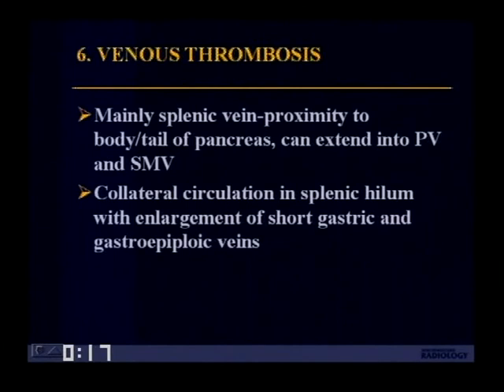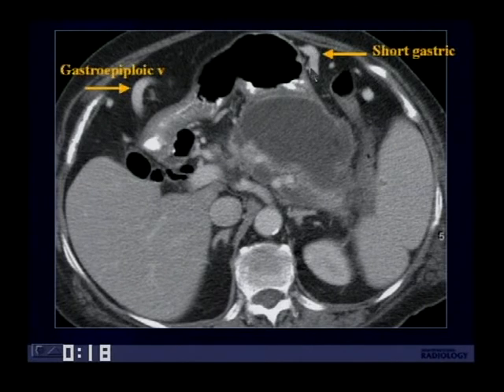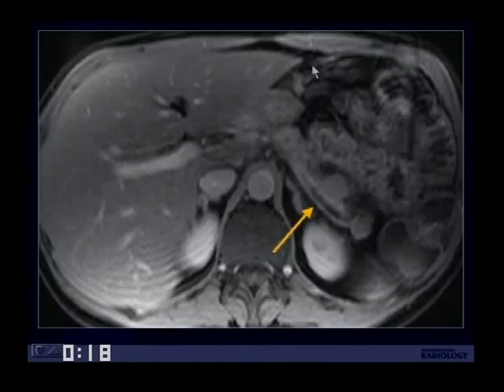Venous thrombosis is a common complication of acute pancreatitis, mainly involving the splenic vein due to its proximity to the body and tail of the pancreas, and it can extend into the portal vein and superior mesenteric vein. You should look for collateral circulation in the splenic hilum as well as enlargement of the short gastric and gastro-epiploic veins. Here's such an example showing absence of the splenic vein with enlarged short gastric and gastro-epiploic veins, indicating splenic vein thrombosis, also confirmed on a T1 spoiled gradient echo post-gadolinium MR image.